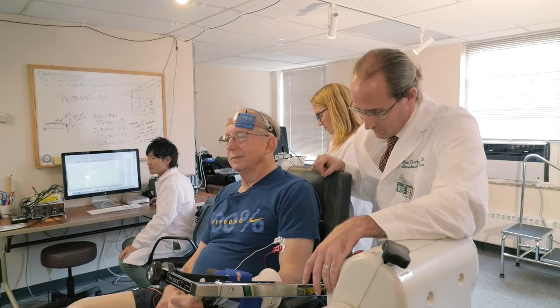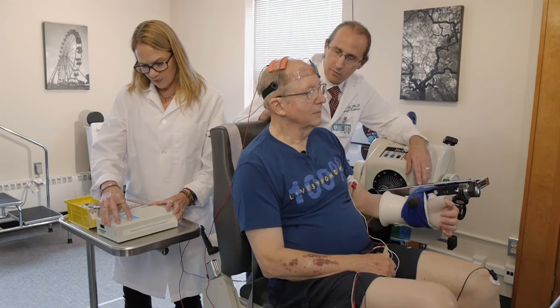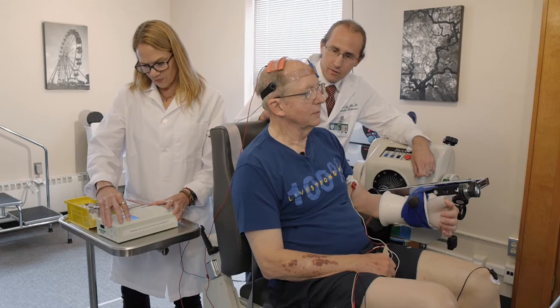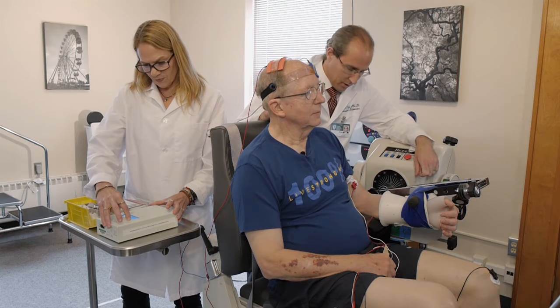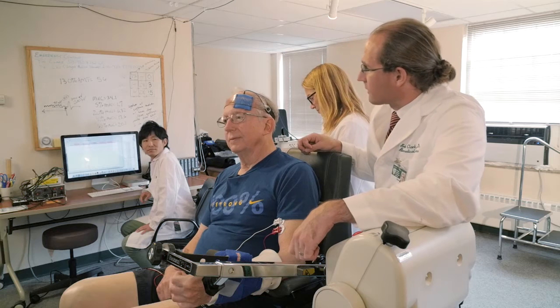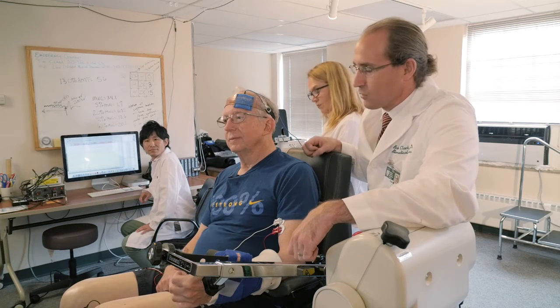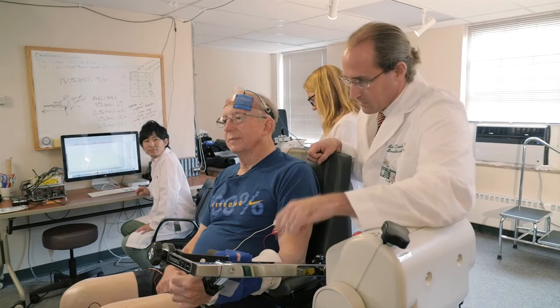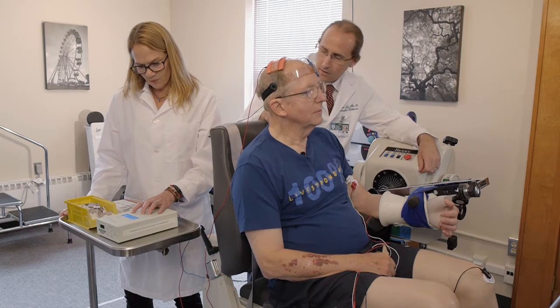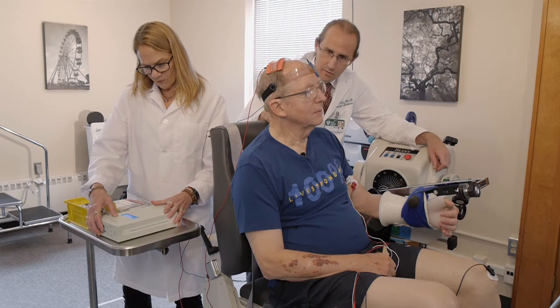Rob, the next test we're going to do involves trying to learn how non-invasive brain stimulation — it's a very low current of electricity that we pass to the brain that you'll barely be able to feel — affects your muscle strength. We're going to turn on a device called a transcranial direct current stimulator. It's going to stimulate your brain very lightly, and Leith is going to turn this on.